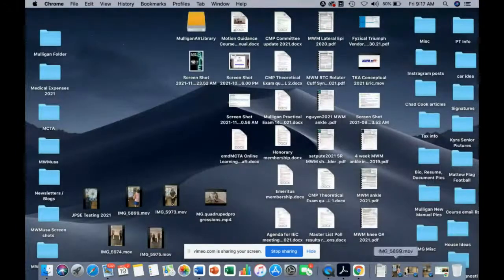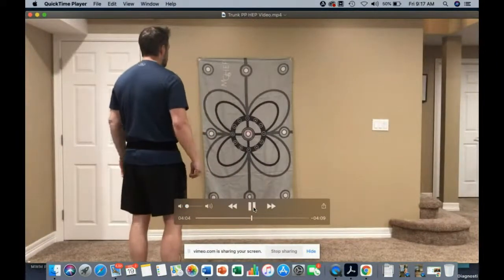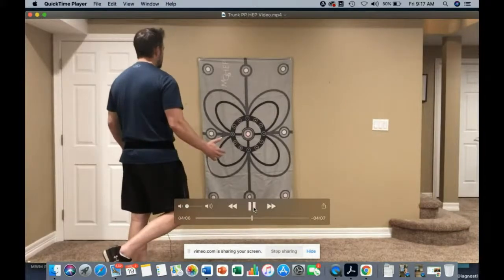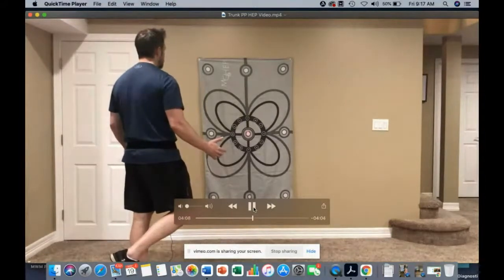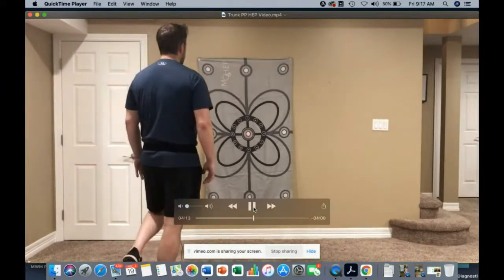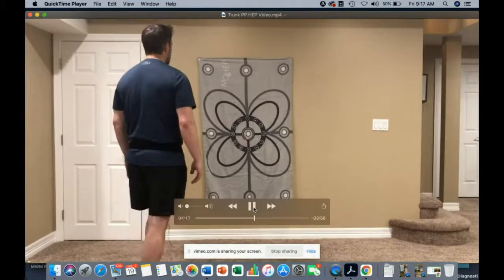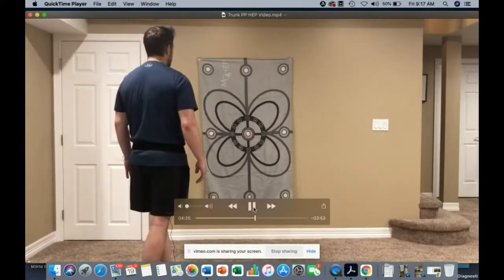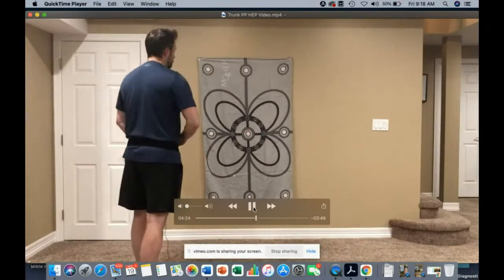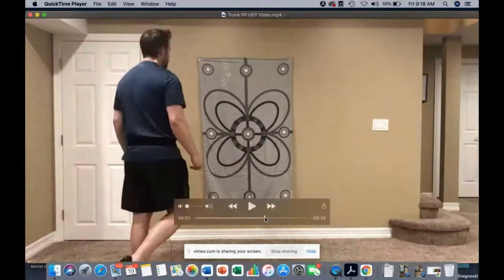And let's move on to some more trunk related things. So you could see here putting the motion guidance around the waist, maybe including some single leg balance for different types of vestibular training, having people understand how their pelvis stays level. If the pelvis has a Trendelenburg type of pattern, they might drop that laser. I moved into a tandem stance or maybe even a Romberg stance there, and have them start moving the laser around.